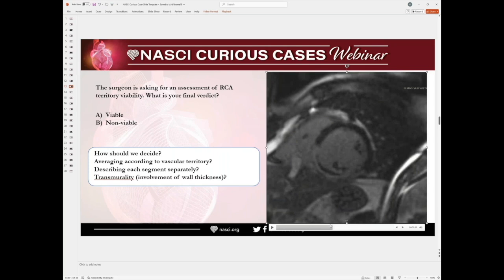I totally agree with you, and in my report I put whatever you said. I was actually going to ask you, can we do the assessment from MRI in acute settings? Is it fair to say it? Yeah, I agree. I'm a cardiologist, not a radiologist, so I'm talking from a cardiology perspective.